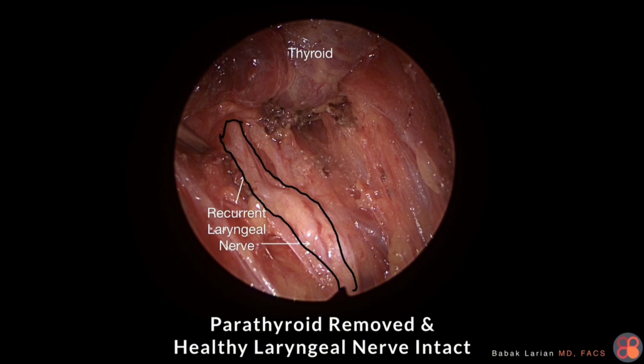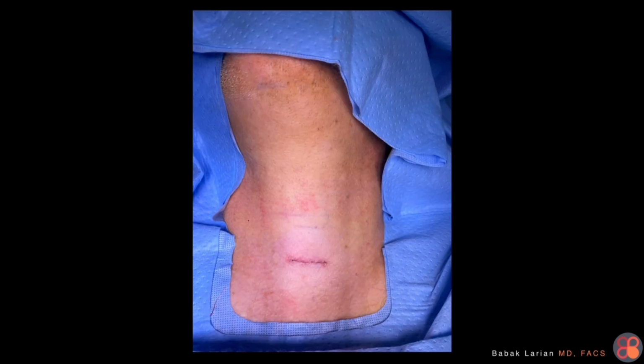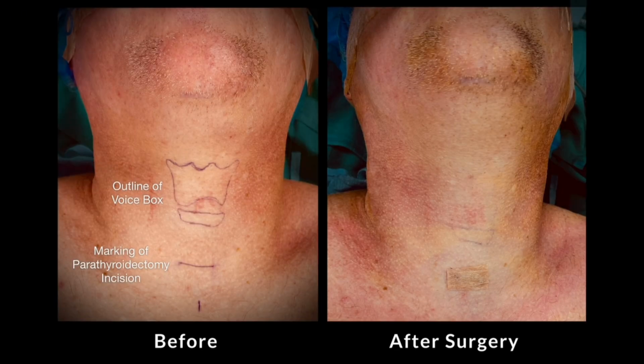So knowing the anatomy allows you to really see the nerve well and do the right thing and protect the nerve and make sure the nerve is okay the whole time you're doing the surgery. That is a priority, to make sure you're keeping the nerve healthy and safe and clear. And this is the parathyroid once it's out, and this is the incision closed. This is before and after, just a little piece of tape on an incision.